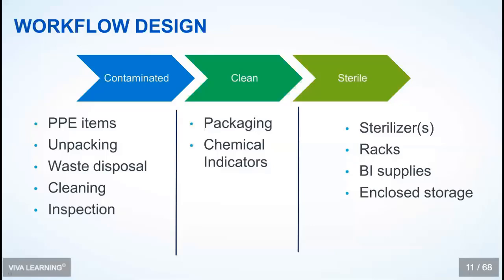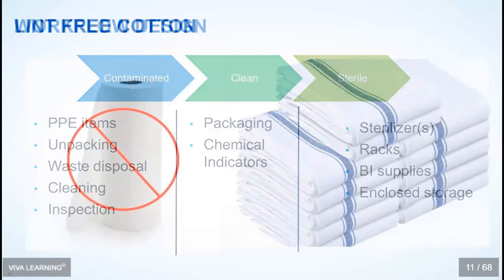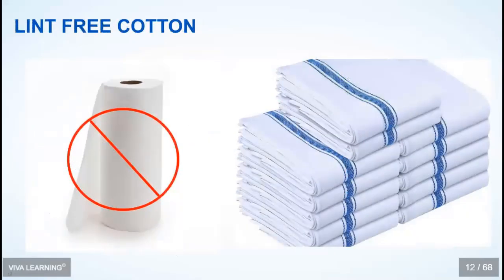And here's just a point that I read this past week. It's recommended that the minimum width, the walkway space in your sterilization area, should be 4 feet wide. And this allows for passersby going in 2 different directions. This is my PSA announcement.